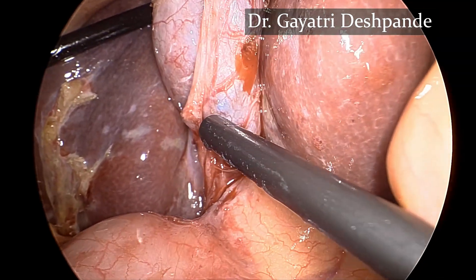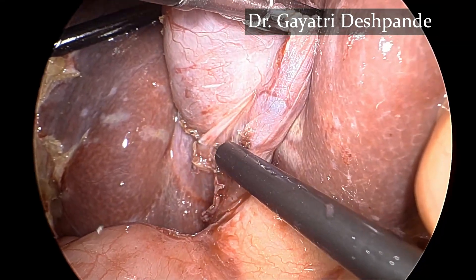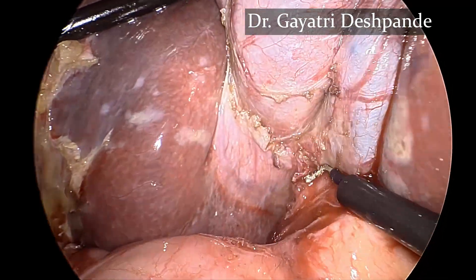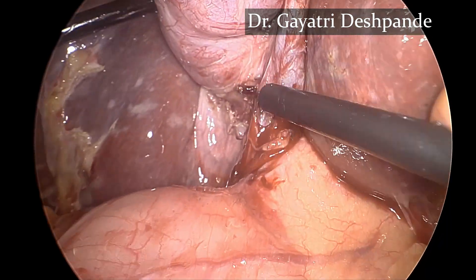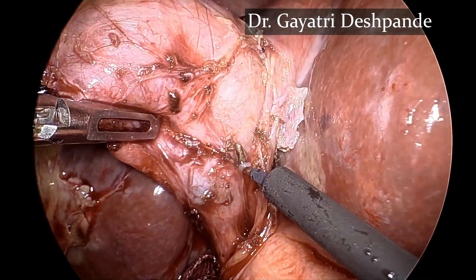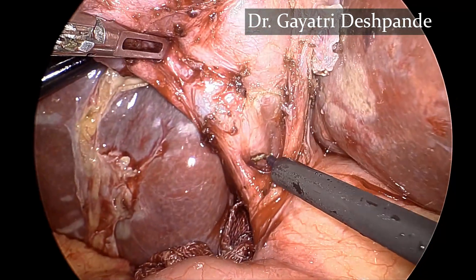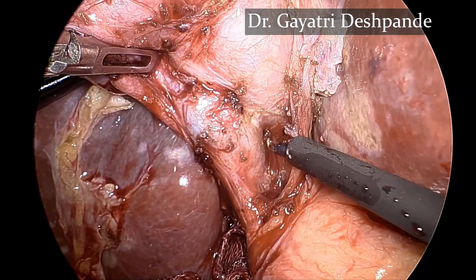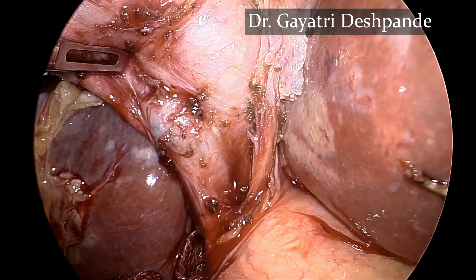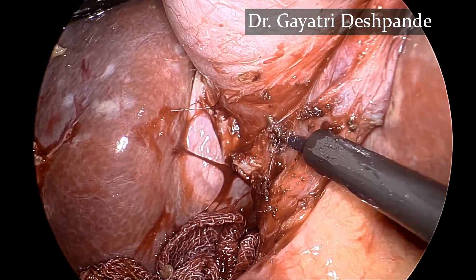The adhesions in front of the cystic duct are cleared and the posterior window is created. The Stryker 1788 system has a 4K camera and a 30-degree telescope. The ICG mode is very helpful in defining the anatomy of the bile duct.